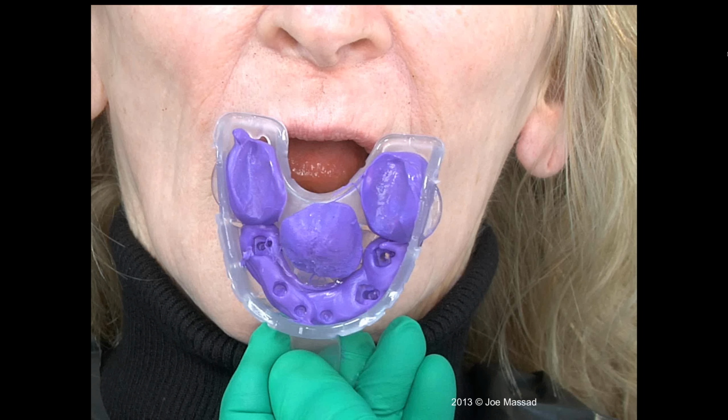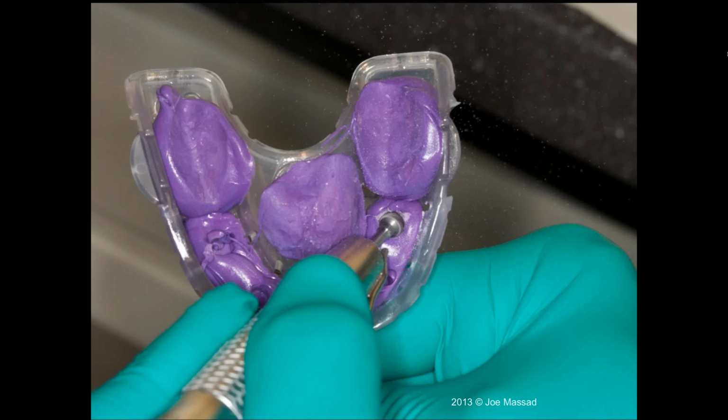So let's take a round burr and cut holes in those 3 areas. Now I still have a very stable tray. I want to try it in and make sure I can retrieve it easily. And now I'm doing borders separately of the final wash.